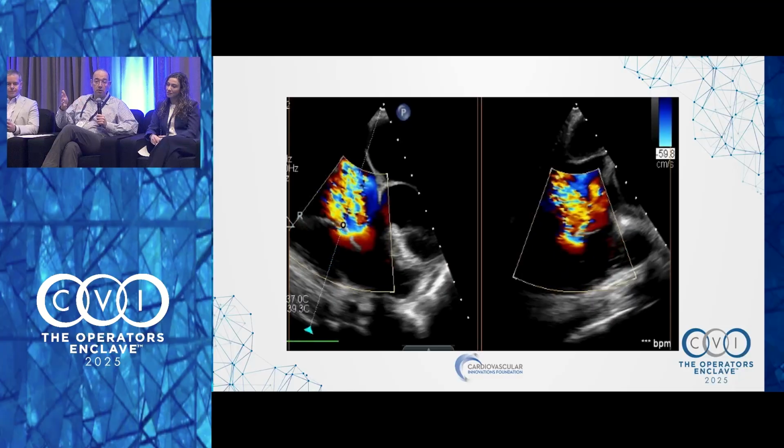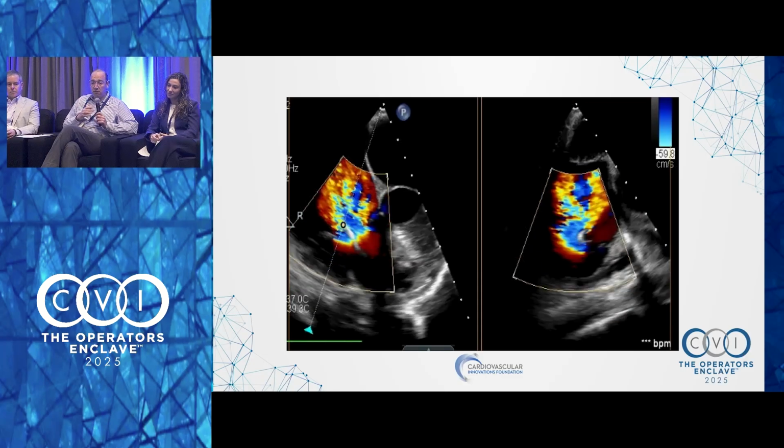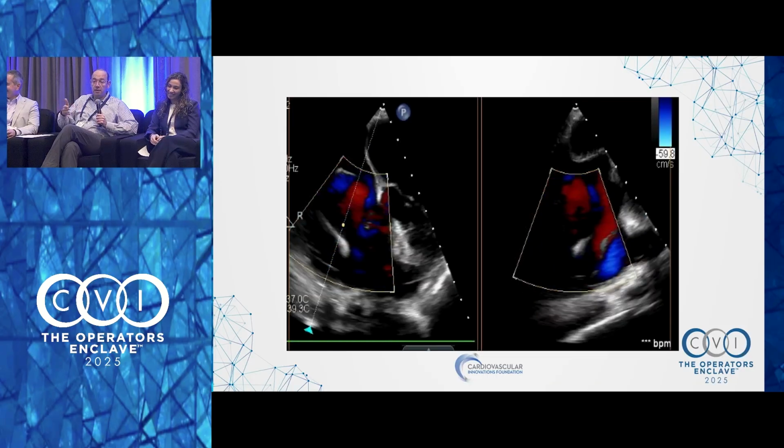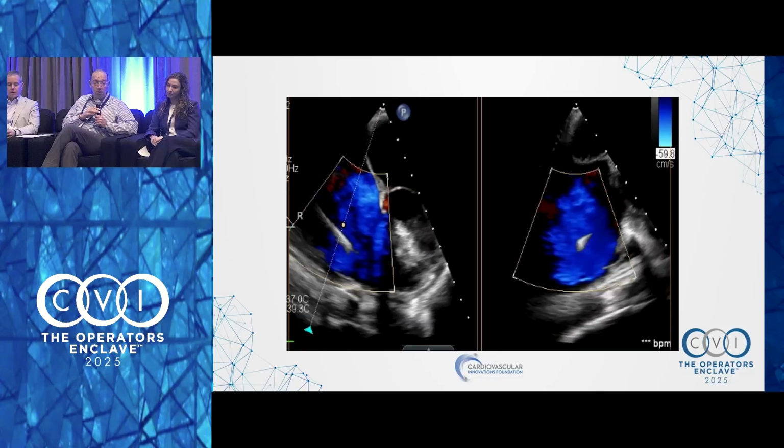When we started doing tricuspid, the only thing that I knew how to do was how to remove a lead. Tricuspid, I had no idea. We just moved leads because it's fun, pissing off electrophysiologists. But then we very quickly realized that we should just leave it, because very often it's connected to the leaflet, and by moving it, we get what you have experienced. And the slack on the lead for TTVR is important to understand as well.